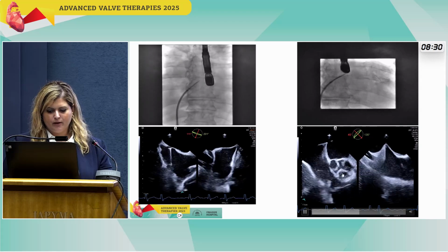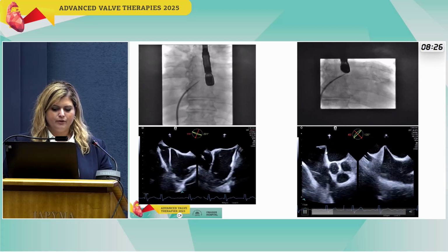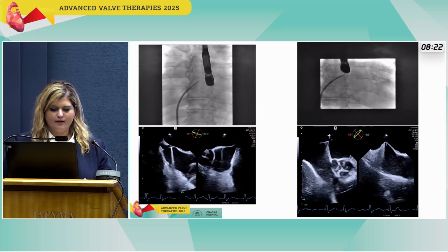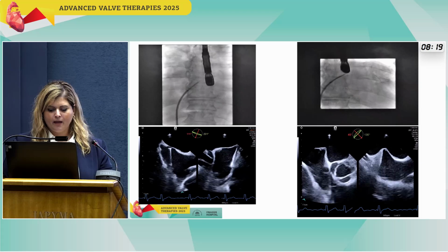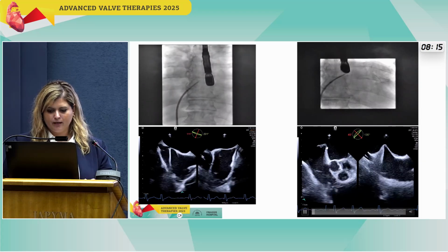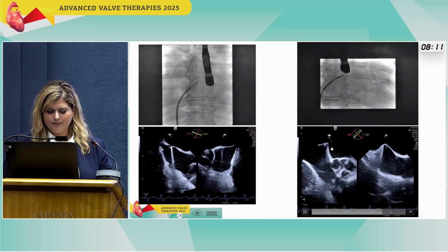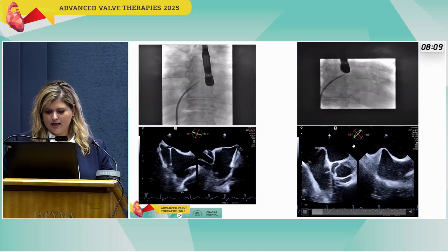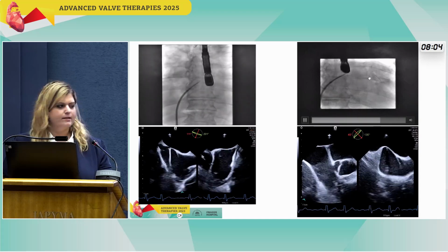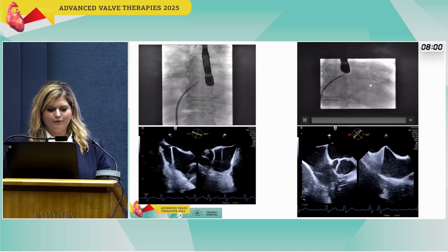It is very important that we are away from the aorta, and it's very important to do the transseptal puncture in the fossa ovalis in order not to have any pericardial effusion. As we can see here, first the tenting from the needle, and then we go through the septum into the left atrium. Afterwards, as you see here, we are inserting a wire in the left upper pulmonary vein in order to have stability.